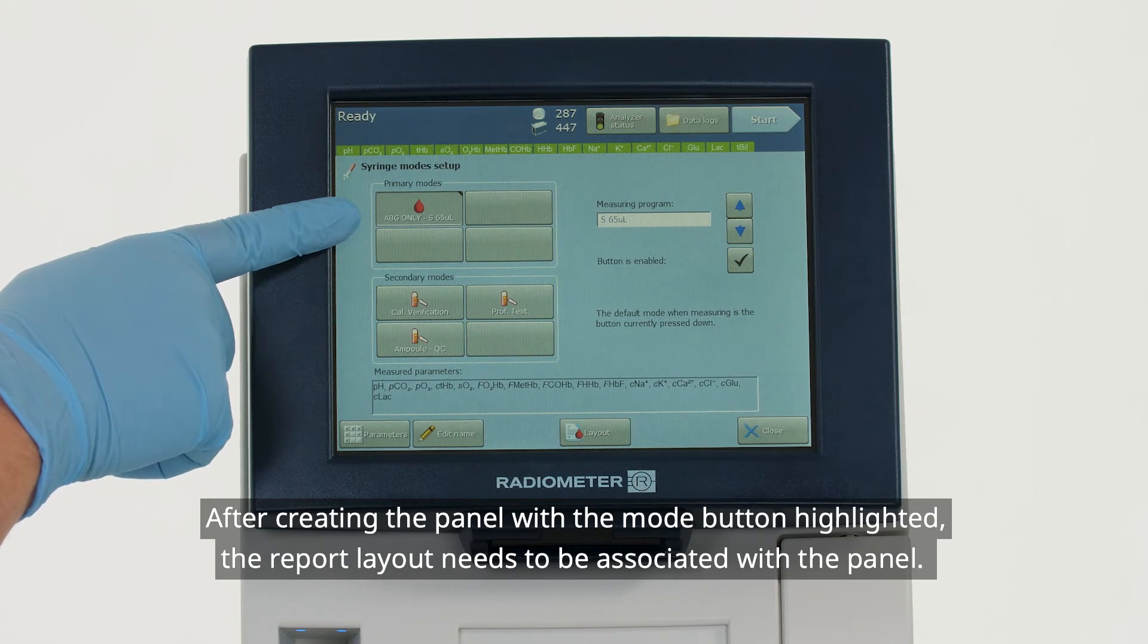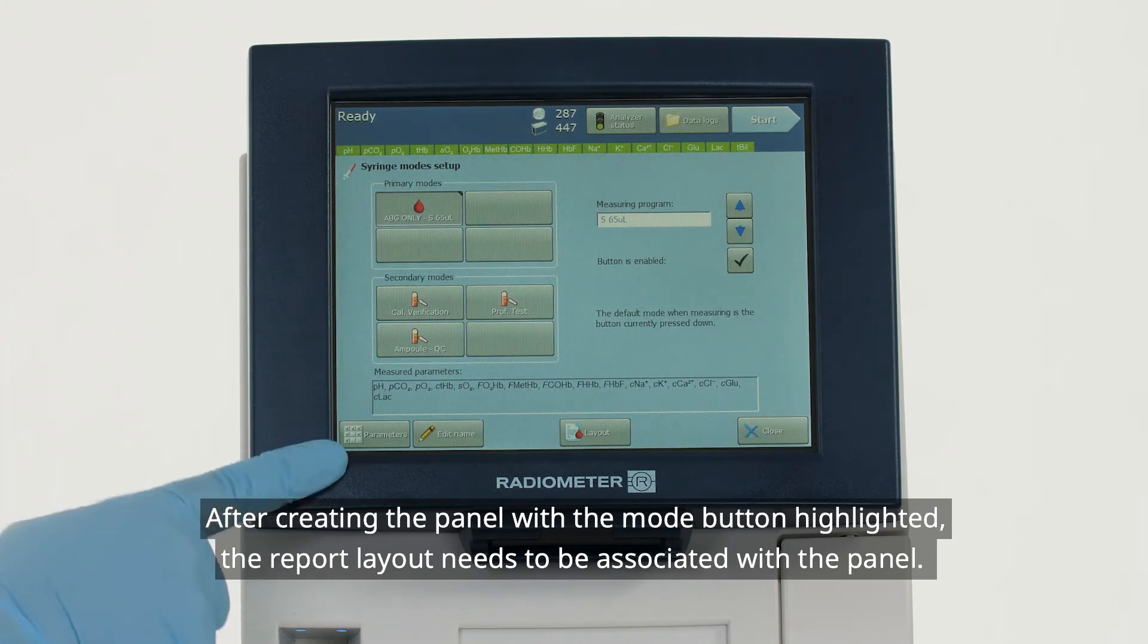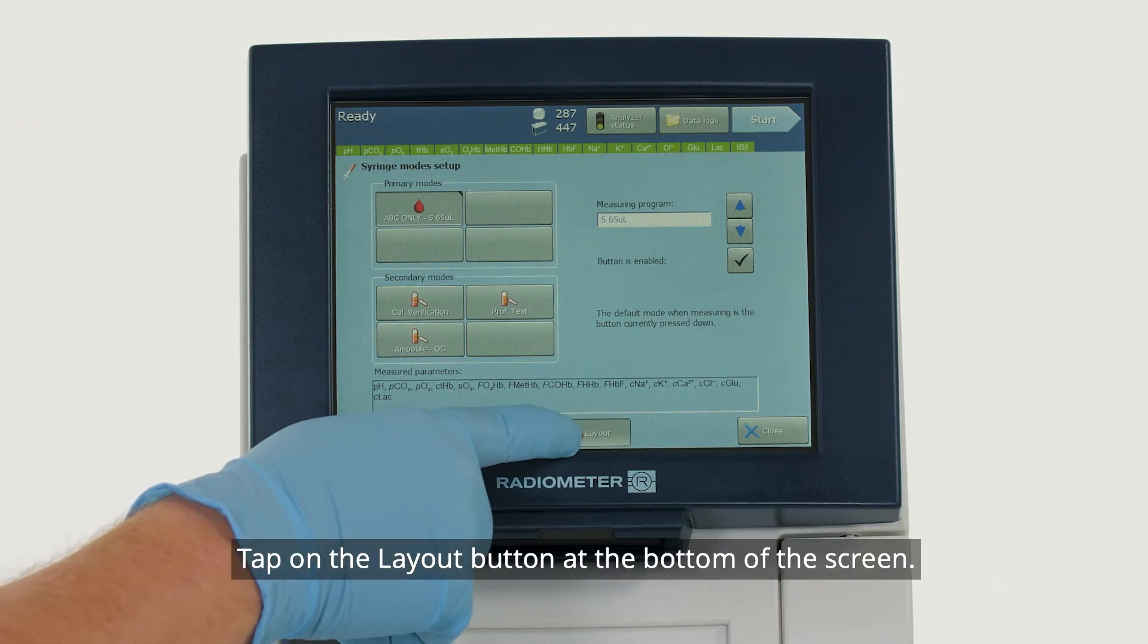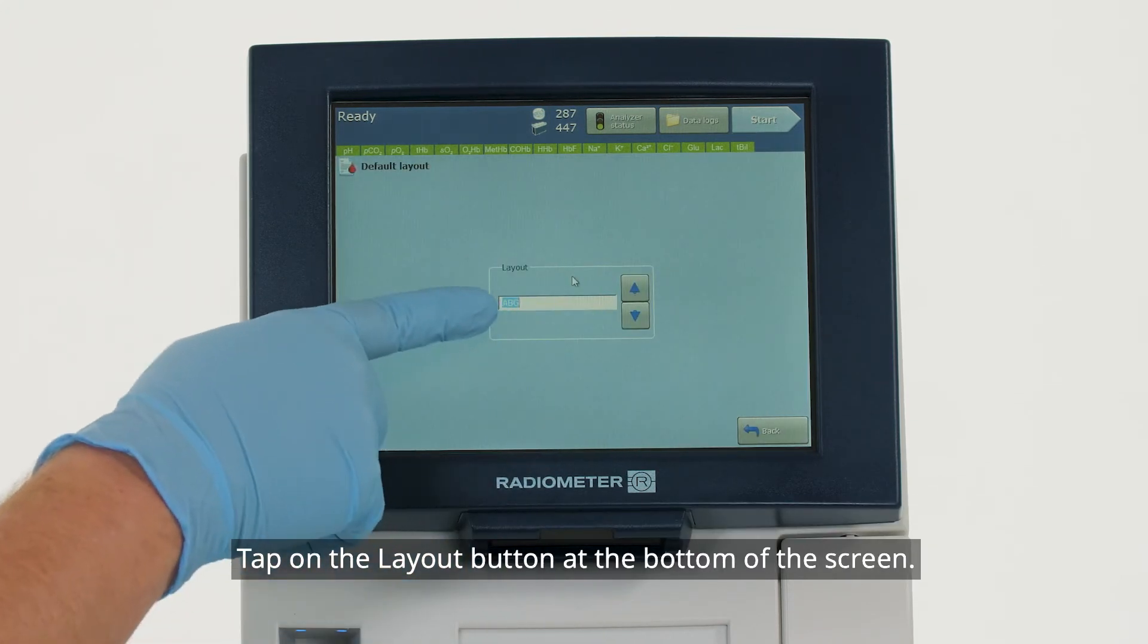After creating the panel with the Mode button highlighted, the report layout needs to be associated with the panel. Tap on the Layout button at the bottom of the screen.